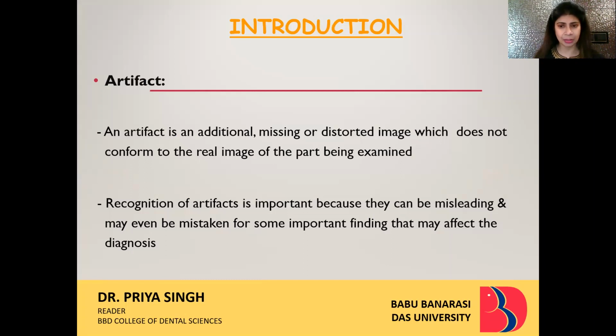part being examined. Now, many a times these artifacts overlie on the pathology or they may overlie on the normal anatomical region, thus creating an impression of a normal anatomical landmark being a pathology, or maybe a pathology being a normal anatomical landmark. So it's very important to know about artifacts. Recognition of artifact is important because they can be misleading and they may even be mistaken for some important finding that may affect the diagnosis.